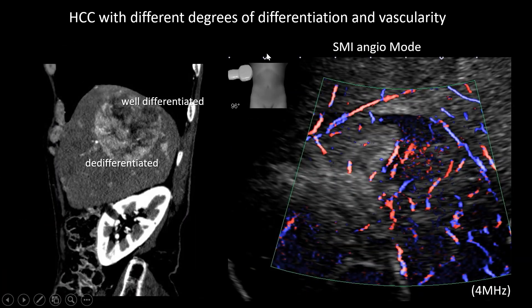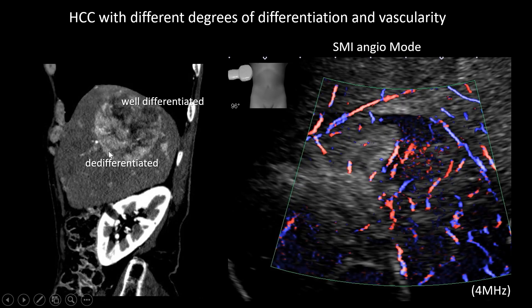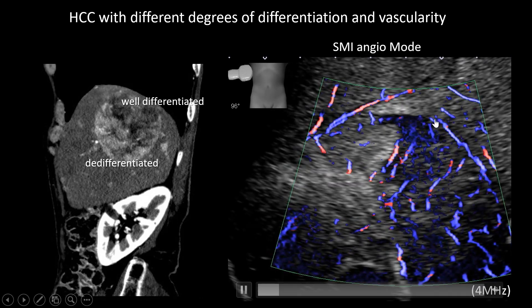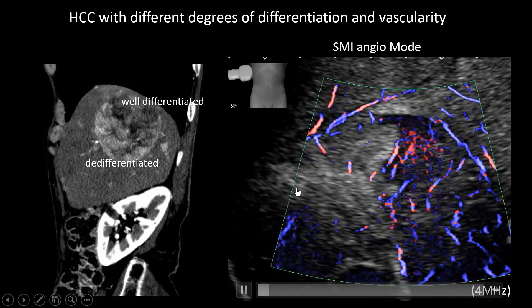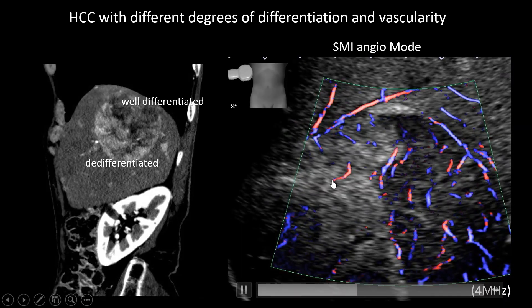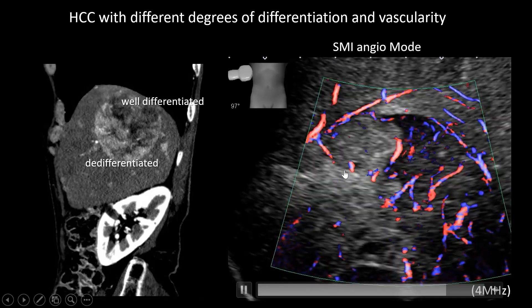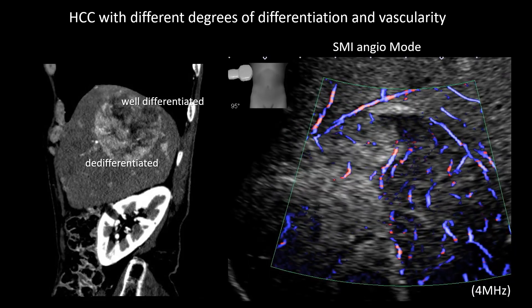This is a case of HCC with different degrees of differentiation and vascularity. This part is rich in fat, well-differentiated, and with less vascularity. This other part is a dedifferentiated area with rich vascularity. Using SMI Angio Mode, you can see the less vascular structure in the well-differentiated area with more fat.